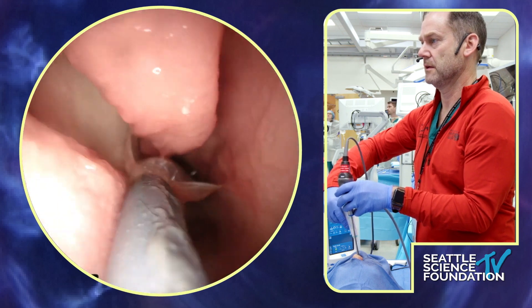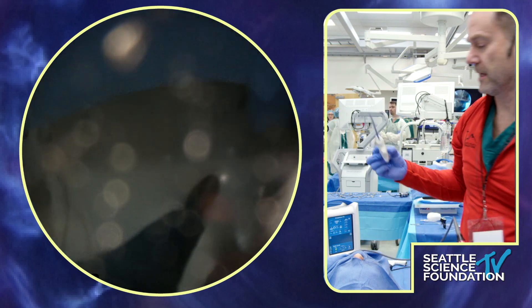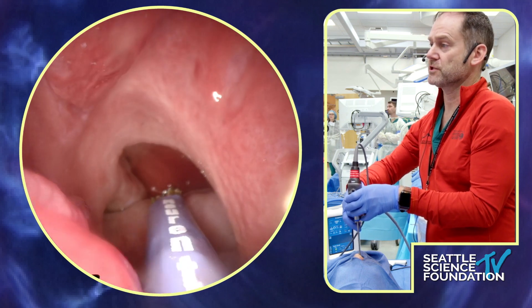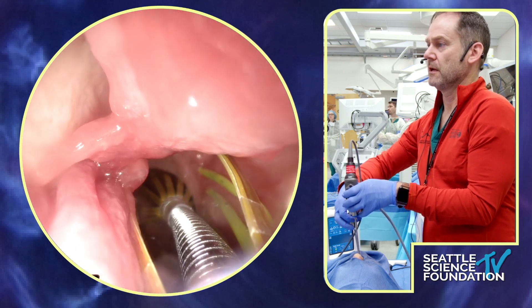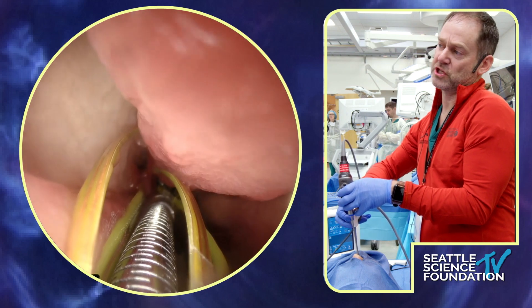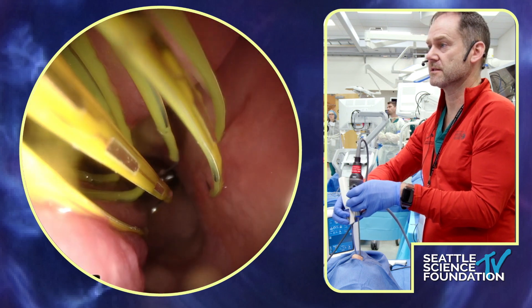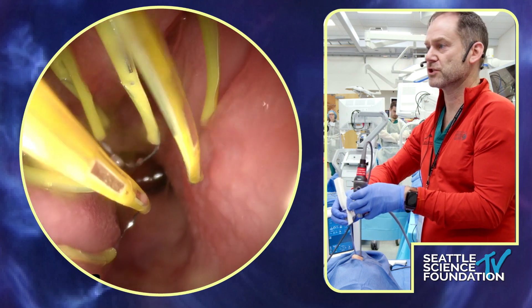The second thing we have is the newest device by Neuro Medical called Neuromark. It uses RF energy for posterior nasal nerve ablation for significant post-nasal drainage. It deploys like this — you see these sets of leaflets. It's nice to deploy in the nasopharynx and then pull it out and back. The machine knows what side you're on, so the leaflets next to the septum are not active — only the leaflets on the proper side. In this patient, the left-sided leaflets are active because we're working on the right side. You can see how it impacts so many different areas.